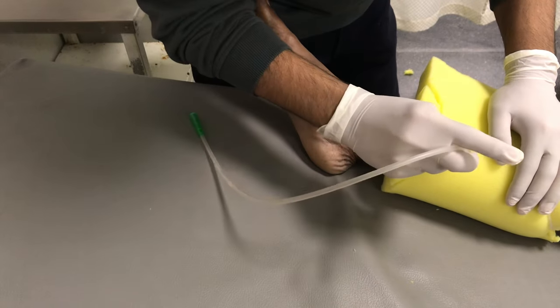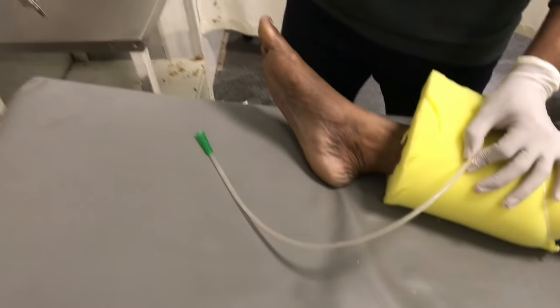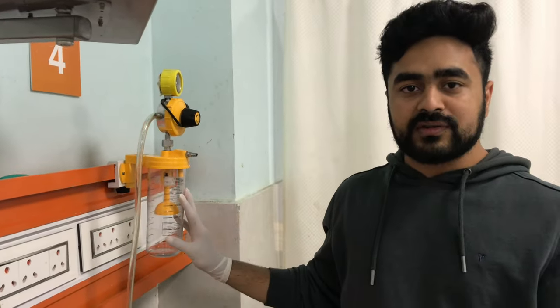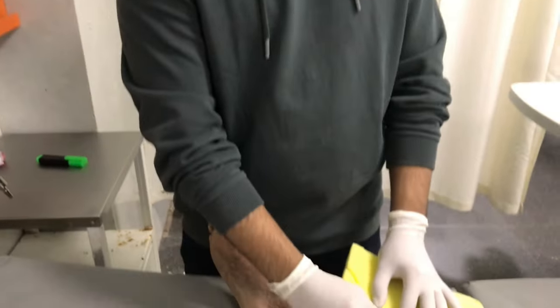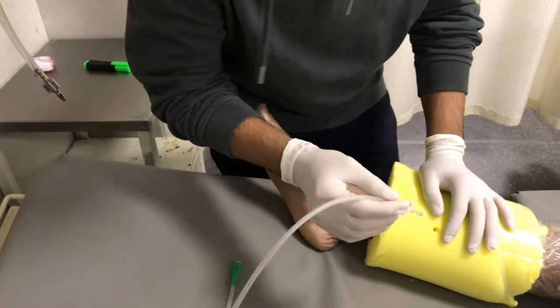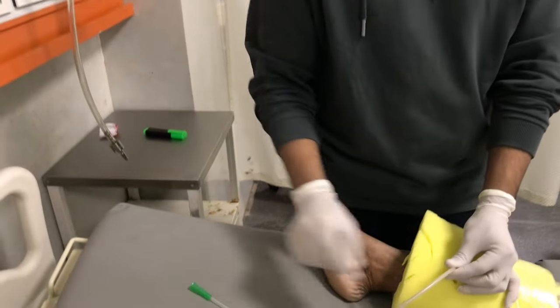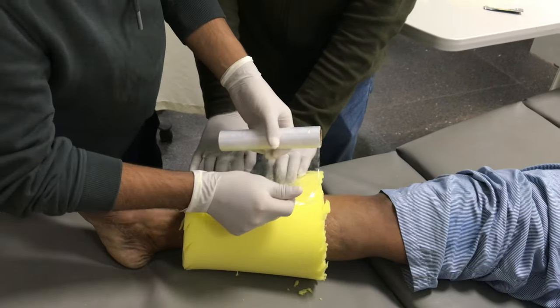After placing the sponge, we will be introducing this catheter — this is the suction catheter — which will be connected to the suction apparatus present in almost all wards worldwide. We will be placing this tip into the wound so that all the debris and the necrotic tissue is suctioned by this, and it is then connected into the separators, which I will be showing later in the video.